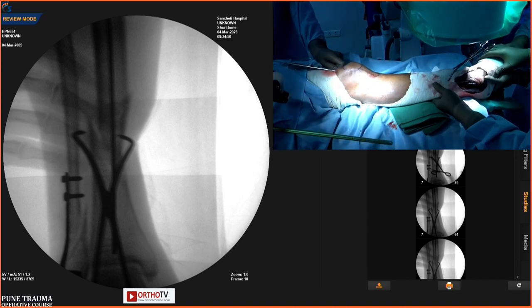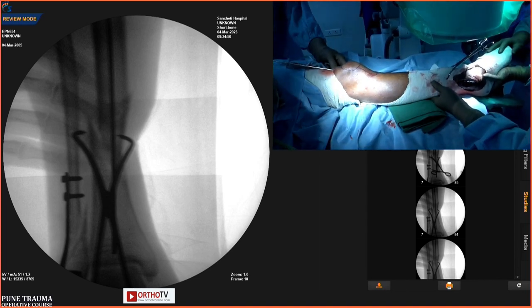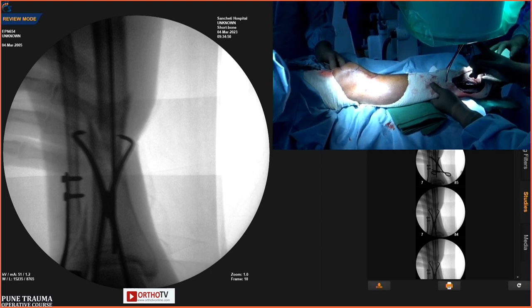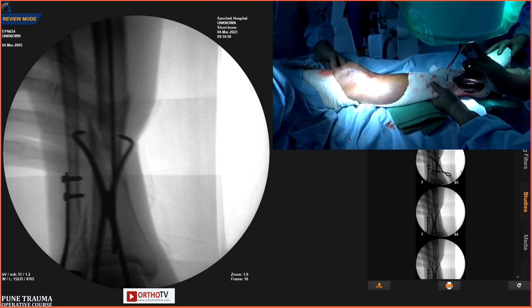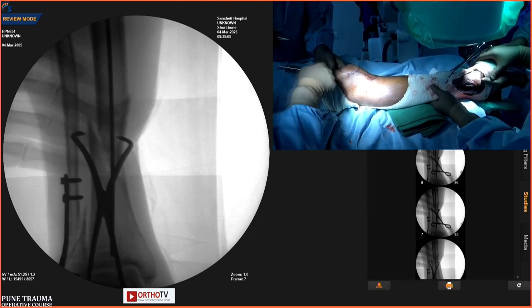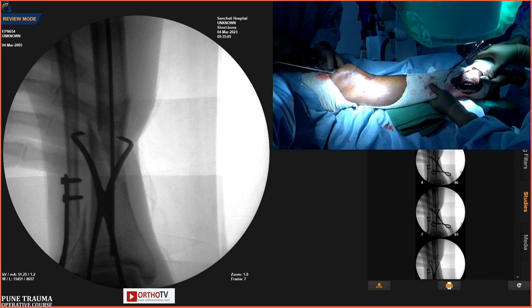Now you can appreciate the center position of your guide wire. Yes, that's perfect, sir. So now he is inserting the nail. We have chosen this is 10 mm.